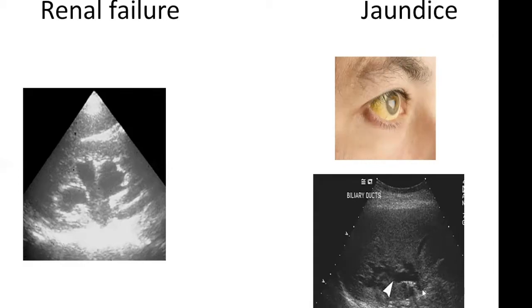The portal vein is posterior. These are the ducts, and they're dilated. You've got to assume there's an obstruction in the common duct or at the gallbladder level or at the pancreatic level. It could be stones, it could be tumour. Then these would be decompressed either across the liver as a PTC or from below an ERCP and relieve the jaundice. It's a surgical cause.